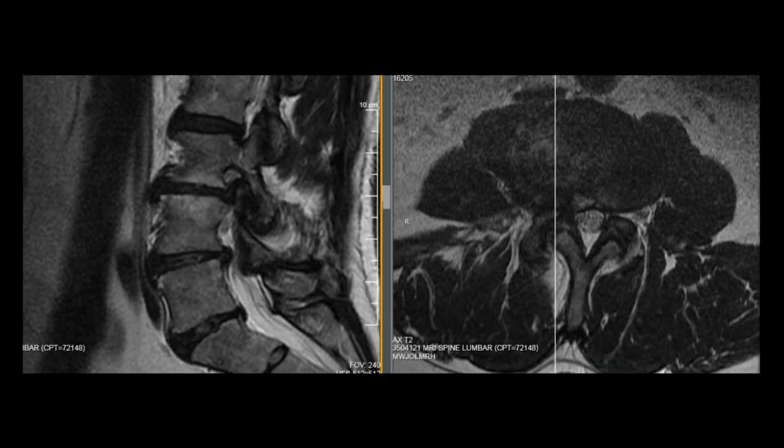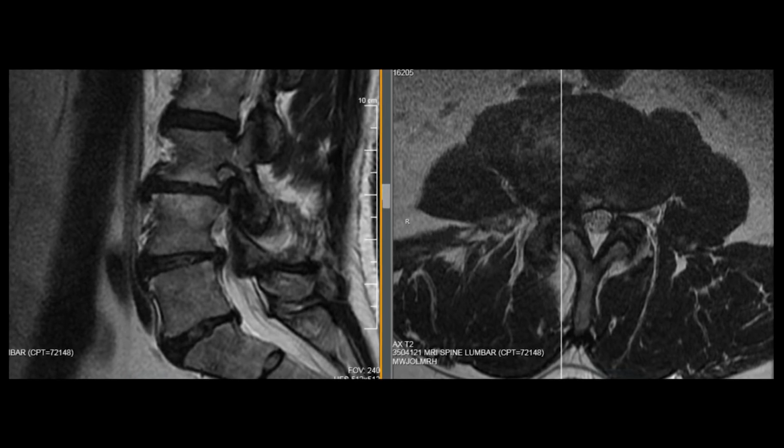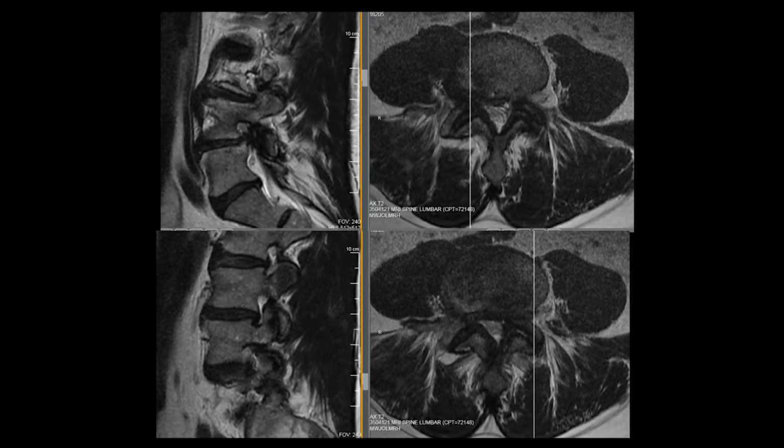And we can see on the MRI in the next picture that's causing some stenosis on the right side at L3-4, bilaterally at L4-5, and L5-S1 on the left side. Now for me, as I approach this case, I need to think about decompression at all these segments. I got to think about restoring disc space height, decompressing indirectly, stabilizing the segments.